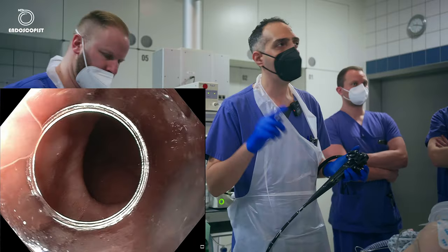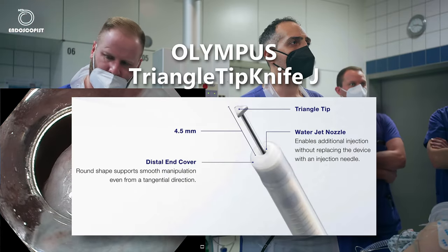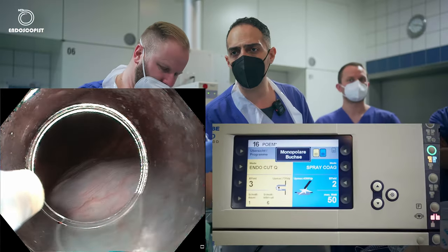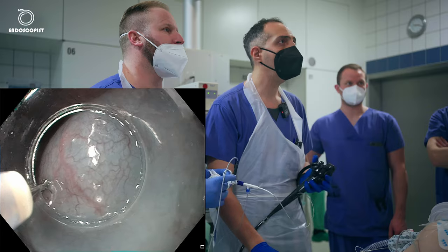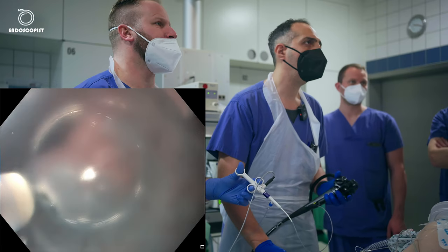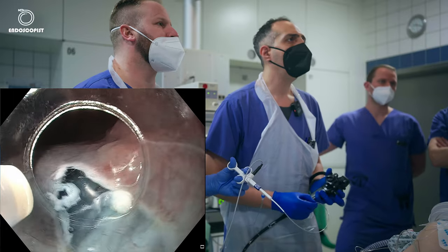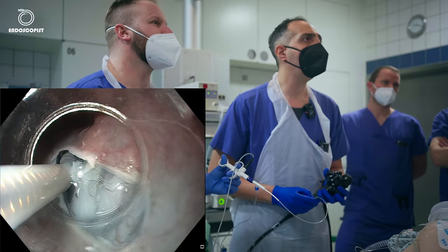Here's our triangular knife from Olympus. Actually, it's a very nice knife to do a POEM with, and you will see why. So I will start cutting with EndoCut Q, effect 3. So I will go from here. As we can see here, the muscle layer is already exposed. What is nice with this knife, I can use it also to inject. So I will give some injection here.